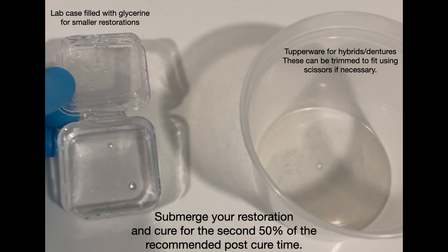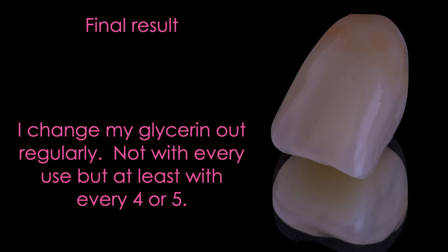For smaller restorations like crowns, I'll use a little lab case — something you'd get a crown or bridge back from the lab in — and just fill that with glycerin. For larger restorations like night guards or the occasional denture hybrid, I'll use one of those takeout soup containers, which you can get really easily at most restaurants. You can trim it with scissors if you need to shorten it to fit into your ODA Flash. You'll submerge the restoration in the glycerin and do the second half of your post cure — for Flexera that's another 3,000 flashes; for SmallGuard I think it's 1,000 flashes for the second half.